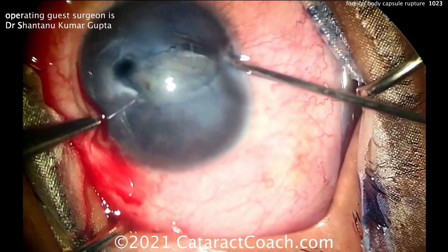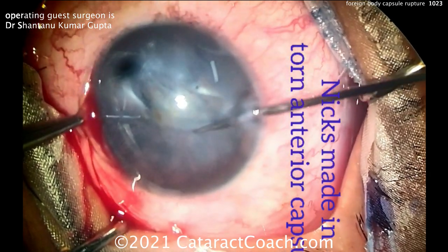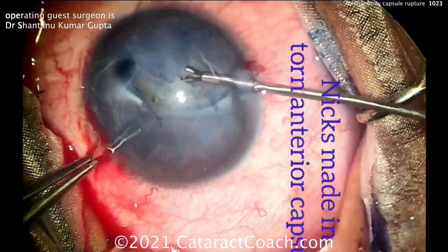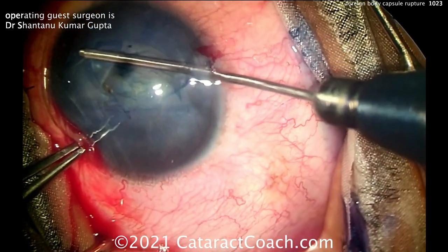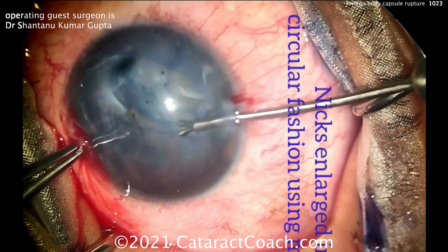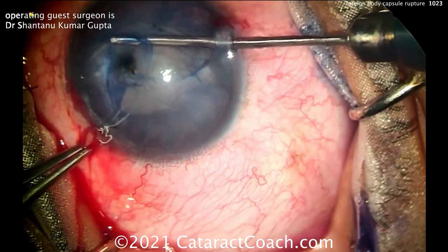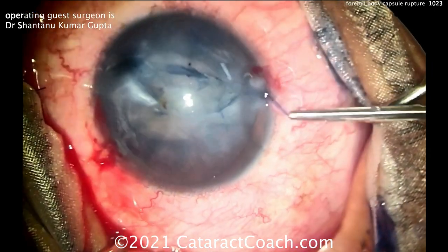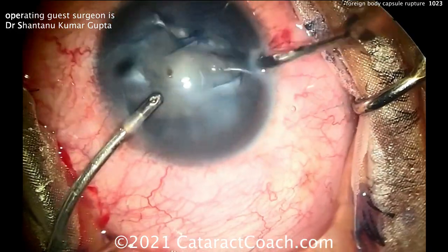The patient had a corneal foreign body that pierced inside the eye and nailed the anterior lens capsule. Trypan blue dye was placed — you can see the capsule is already ruptured. Small nicks were made in the lens capsule with small gauge scissors, and now a capsulorrhexis is being done to the best of your ability. With this irregular break in the lens capsule, you can't create a perfectly round rhexis — but you don't necessarily have to.